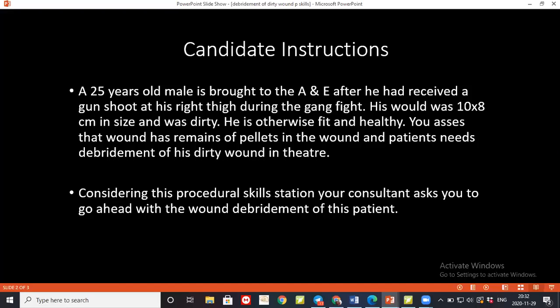This is a procedural skill station. Today I have been asked to perform adequate permission from the patient to do wound cleaning for this patient under some local anesthesia in the theater. Before going any further, I'd like to check if there is any x-ray of this patient available to see the wound status — if there are any foreign bodies or debris over there.